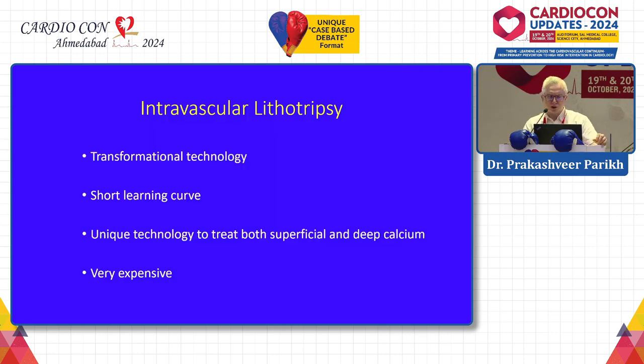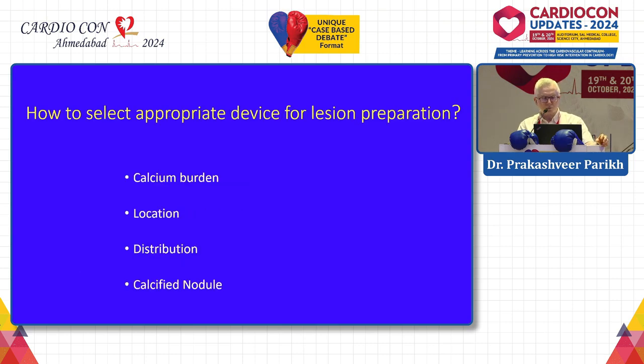Intravascular lithotripsy is a transformative technology. It has a very short learning curve, and it's a unique technology because it is able to treat both superficial as well as deep calcium. But unfortunately, it's very expensive, so we can't use it in all the patients.